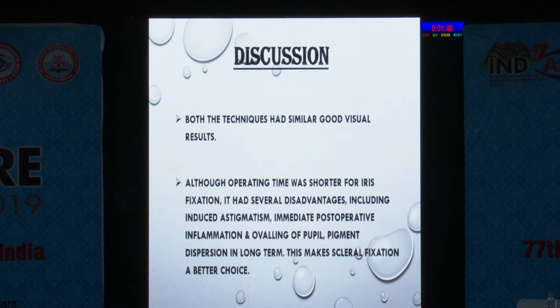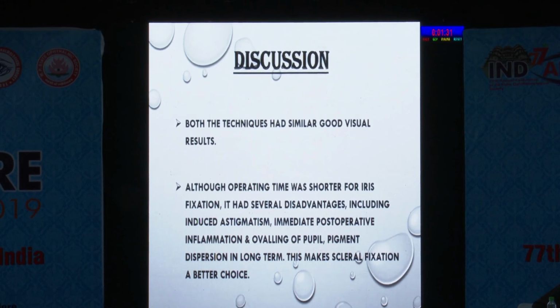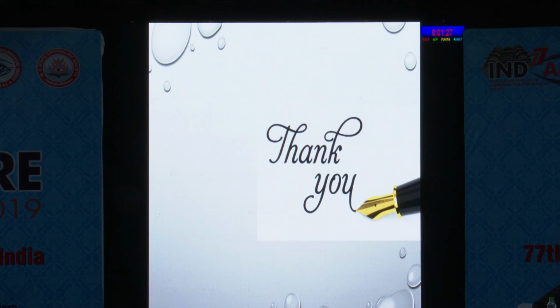So for discussion, both techniques had similarly good visual results. Although the operating time was much shorter for the iris fixation, it had several disadvantages, which included astigmatism, immediate post-op inflammation, ovaling of pupil, and pigment dispersion, and that makes scleral fixation IOL a better choice.